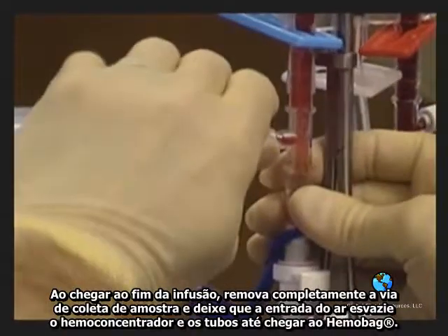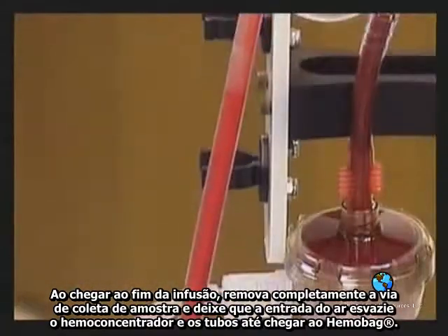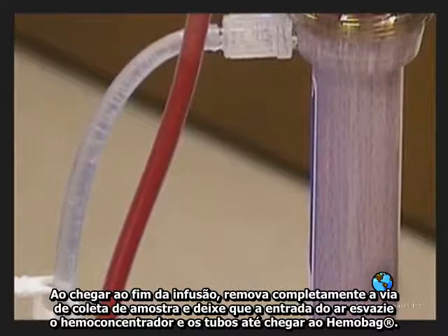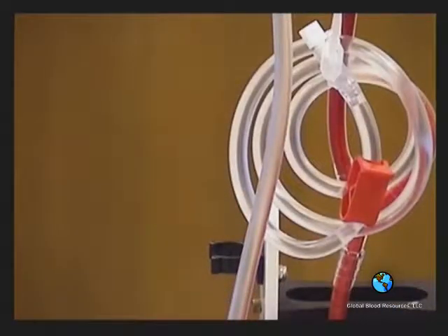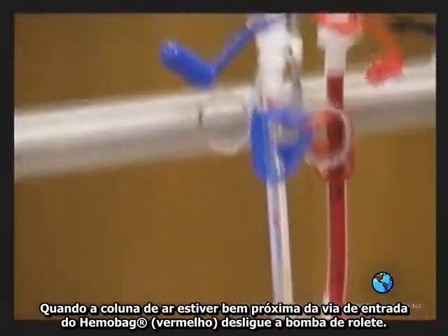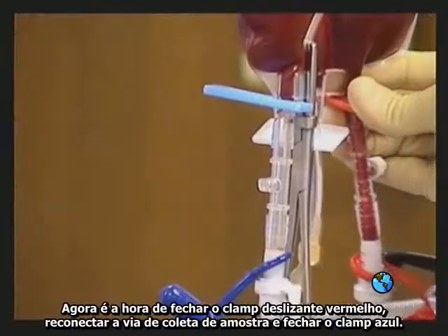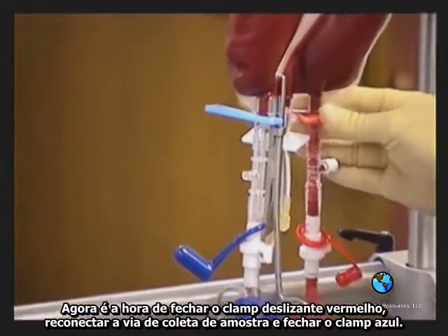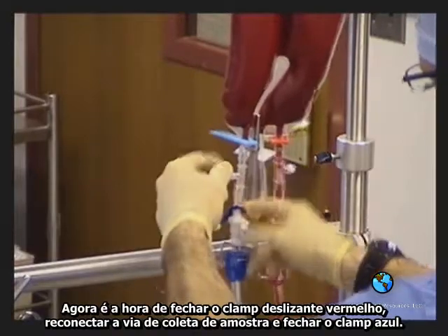When you reach the end, completely remove the needleless sampling port from the luer and let air now chase the hemoconcentrator and tubing set clear back to the hemobag. When the air reaches the bottom of the hemobag's return line, stop the roller pump. Now it's time to close the red slide clamp and also return the needleless sampling port to the luer and close the blue pinch clamp.